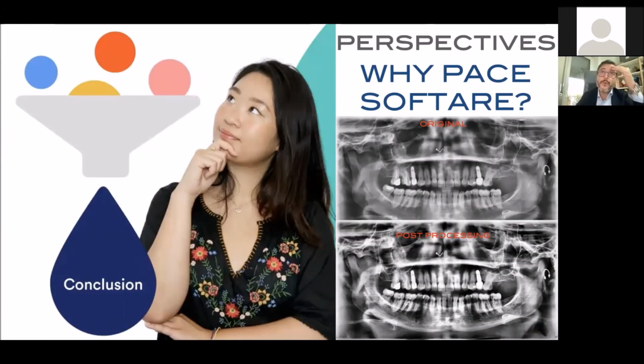After having focused on the above-mentioned points, why then use the software PACE? Because the contrast and detail enhancement of panoramic radiographs helps dentists to better evaluate the anatomical structures of the teeth present in the image using less radiation dose. For this reason, an algorithm for contrast and detail improvement of panoramic dental radiographs is presented in this project. In addition, the help of dental specialists in the qualification of the results obtained by the algorithm is highlighted.